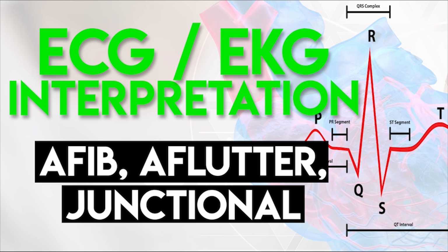All right, you guys, like I said, this is going to be our 4th lesson in this series in which we continue our discussion about arrhythmias. Specifically, in this lesson, we're going to talk about our atrial and junctional arrhythmias.